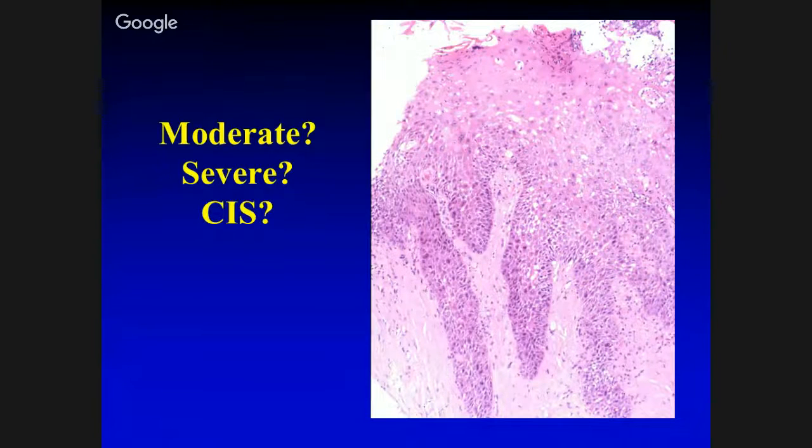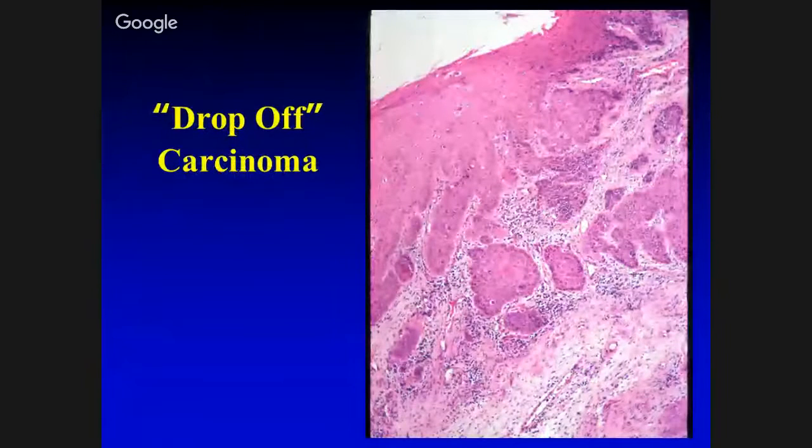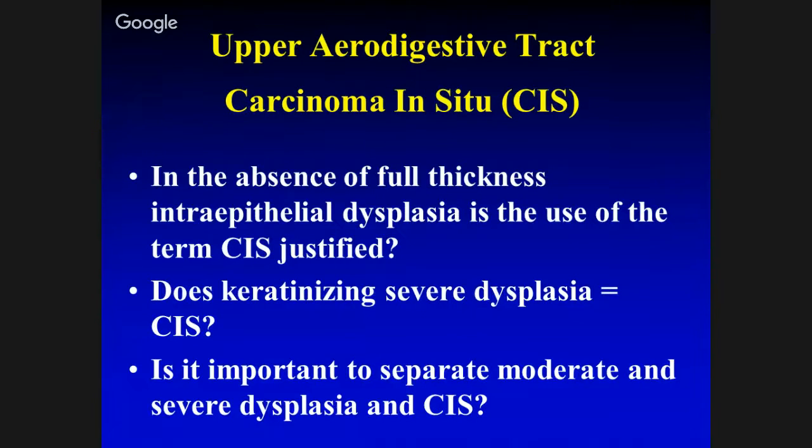How much do we accept? If you use the model of non-keratinizing dysplasia, where the epithelium is limited to the lower zone, this is beyond the pale because of the architecture. One could say, well, 2/3 of this is benign, so why isn't this mild? And the reason for that is this example. If you look at the epithelium, most of it is cytologically bland, yet you have an invasive cancer growing off these elongated rete right here, in which most of this epithelium is benign. So that's why the grading has been subjective, and we're trying to take out the subjectivity.